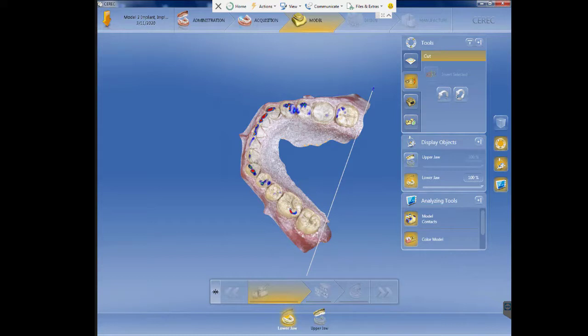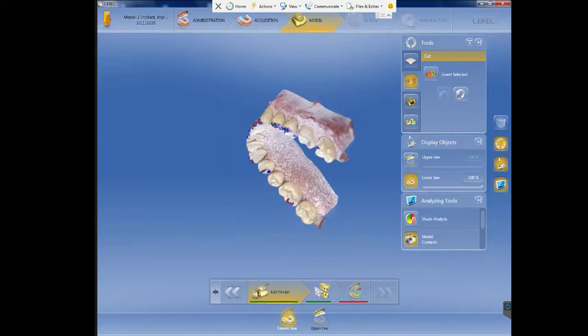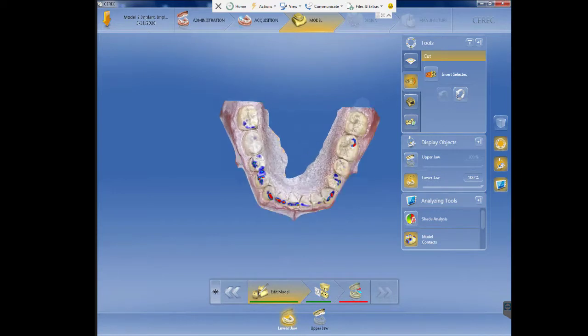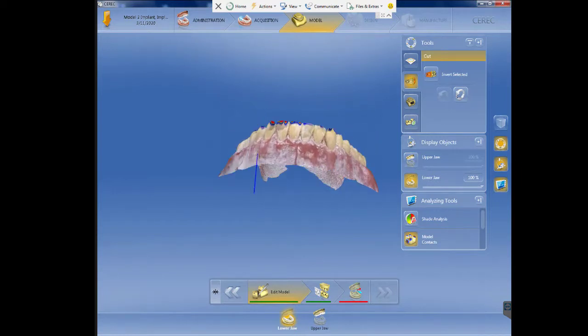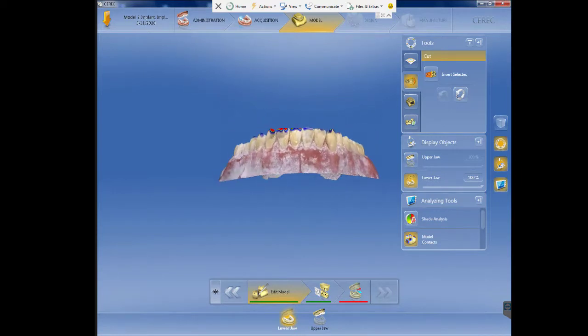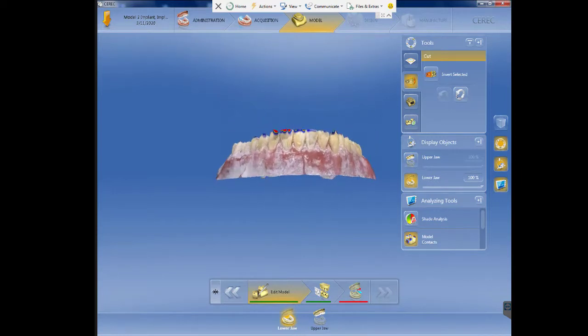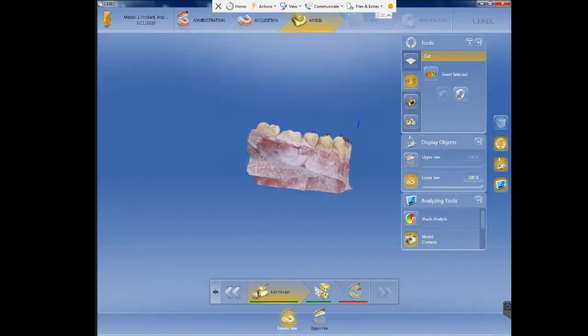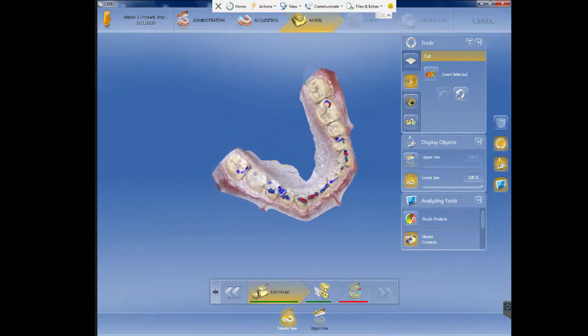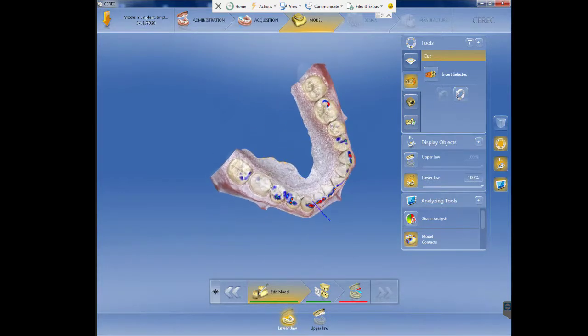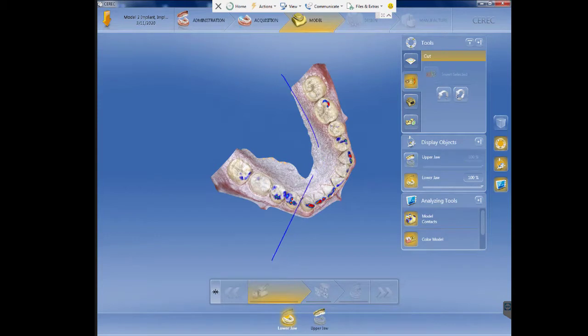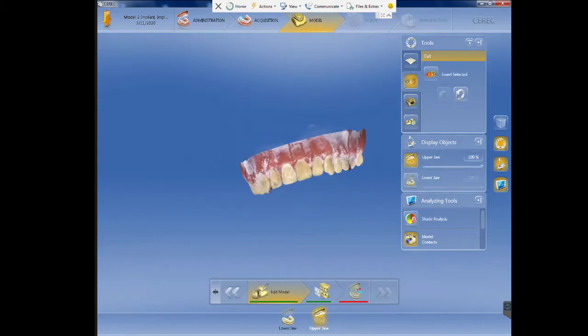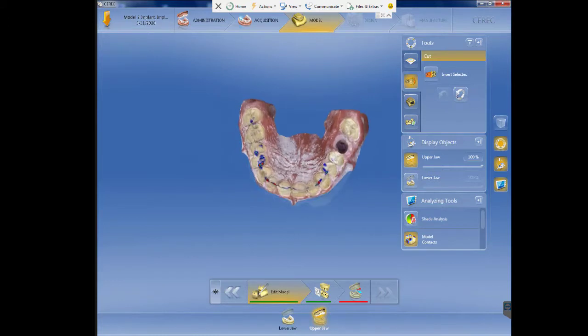Once this is finished we check that we have clean surfaces. Here we can check and confirm that we don't have scatter or holes in the scan. We will just clean all the areas that we don't want. This is because we have to idealize that later on we will create a model from this.